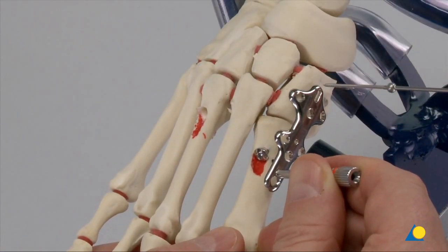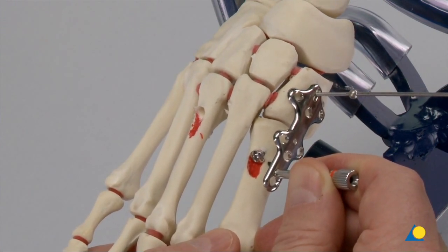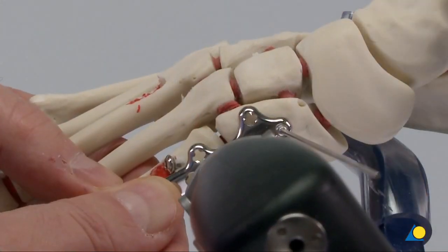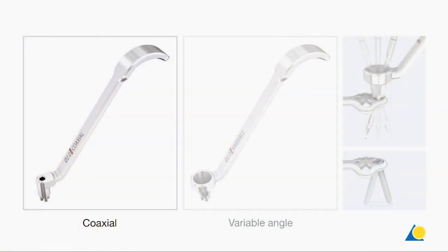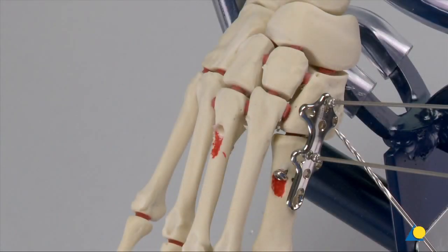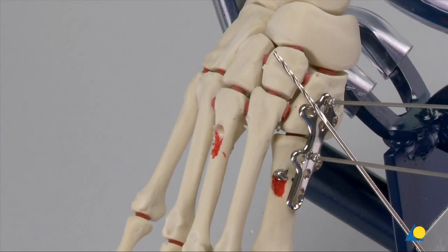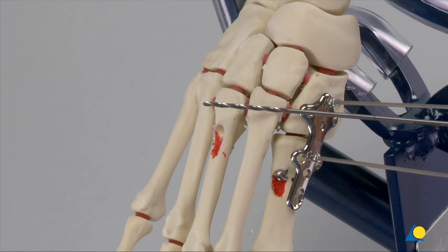The plate is positioned and provisionally attached using the compression wires. The compression forceps can then be used to provide additional compression if needed. Either a coaxial or variable angle drill guide may be utilised with the 2.0 mm drill bit to prepare the screw holes for the locking screws. The conical variable angle drill guide allows for 15 degrees off of centre in any direction. The variable angle technique can be used to direct some plate screws into the intercuneiform area and some all the way across the intertarsal region for greater construct stability.